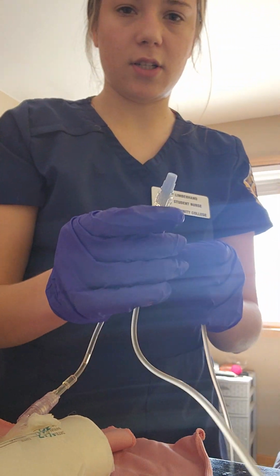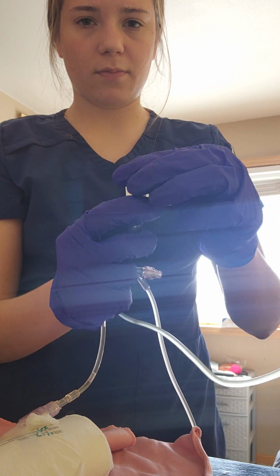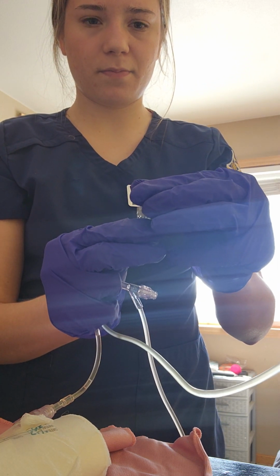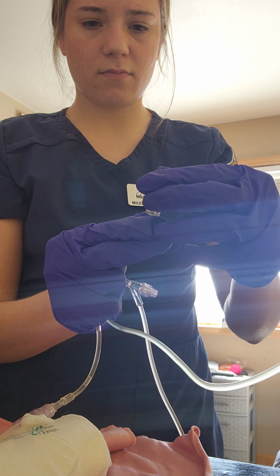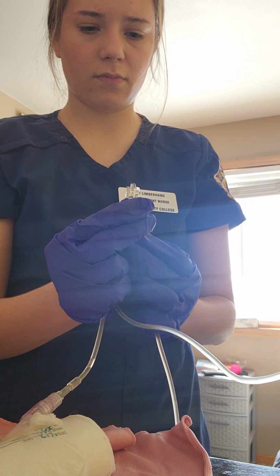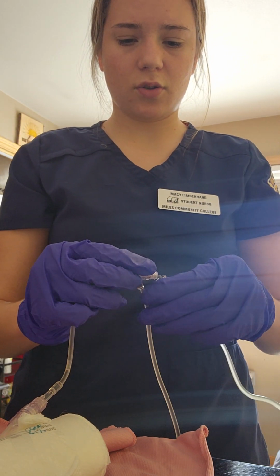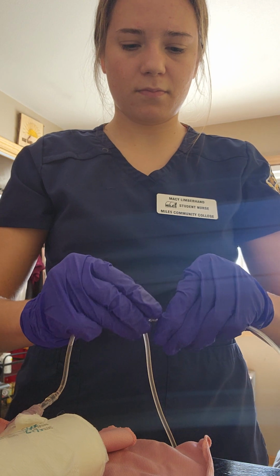And then I'm going to take the cap off of my Piggy Back, and connect it to my normal saline line.